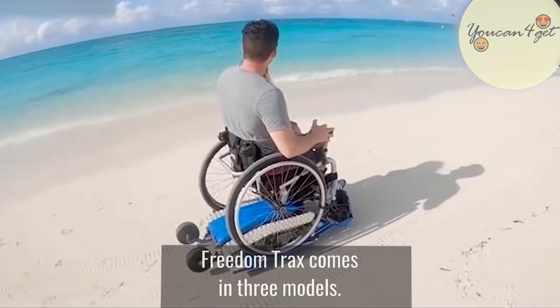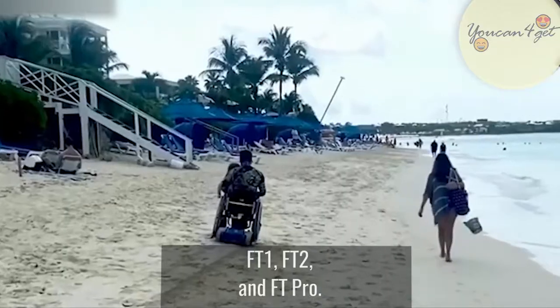Freedom Tracks comes in three different models: FT1, FT2, and FT Pro.